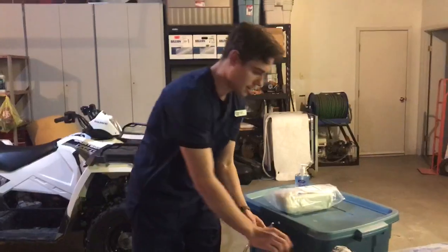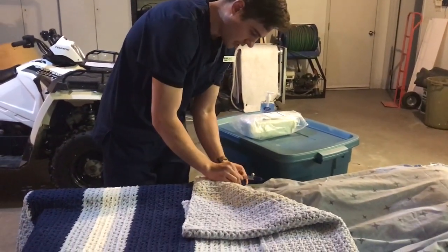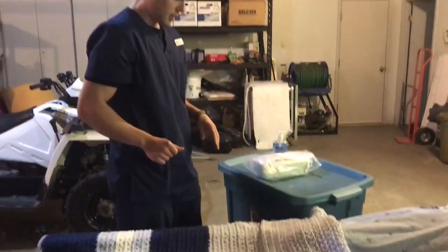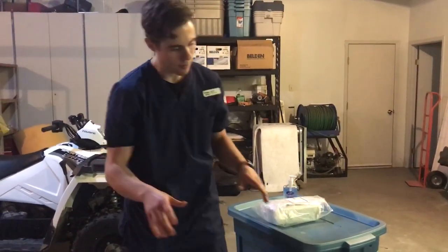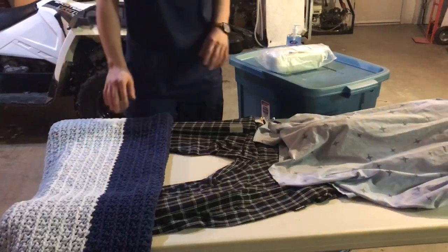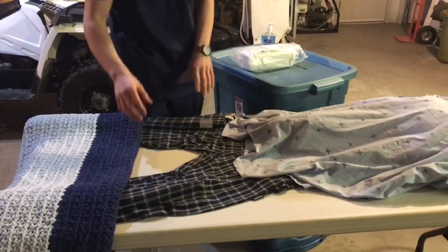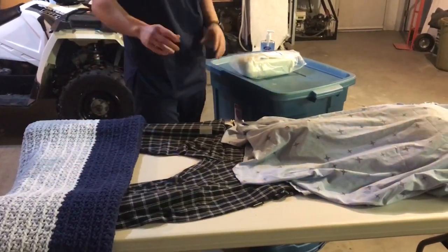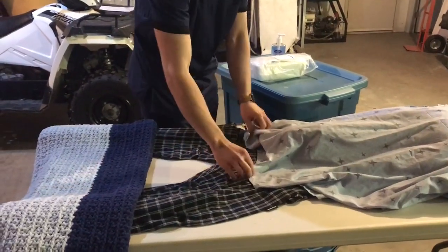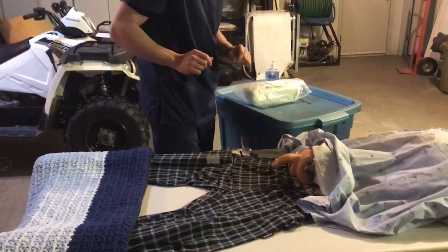Once that's hooked on, I'm going to attach the tubing to a part of the sheets there so we can access it later, keeping the tip sterile. Once that's done, I'm going to pull the covers back, and I'm going to assist our patient into the appropriate position. So that's supine with the thighs slightly abducted because he is male. And I will place an absorbent pad underneath him. Then I'm going to pull the gown back, exposing his genitals.